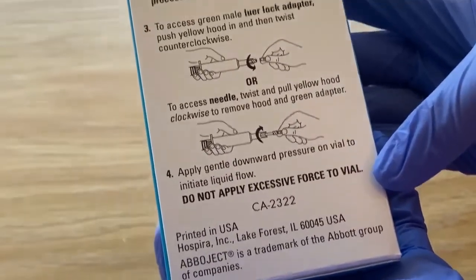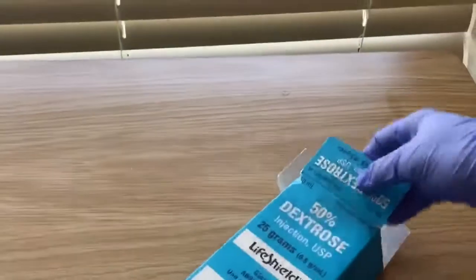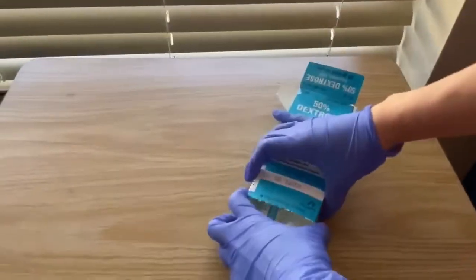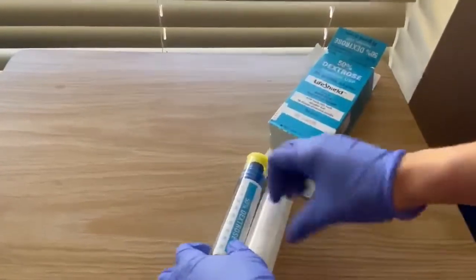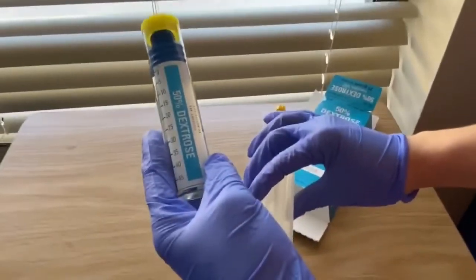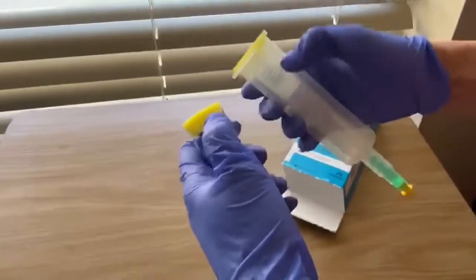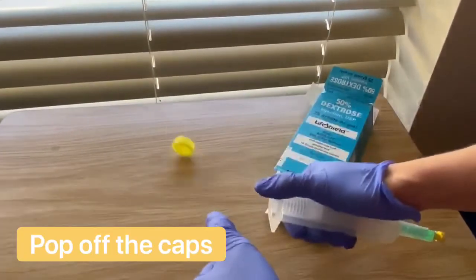This particular vial is 25 grams for the 50% dextrose, so this whole vial is 25 grams. As you can see here, it comes in two different bottles. The first one is on the left side — that's the vial with the medication in it, that's the D50. And then the adapter itself.